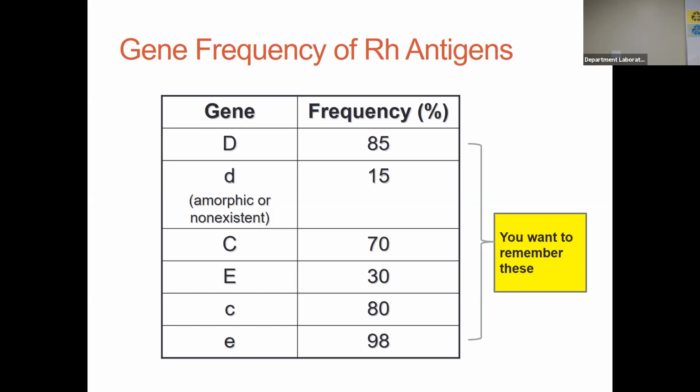All right, so that's why, and this is a real world situation. It happened to me. If you are in the blood bank on the weekend by yourself and a female comes into the OR and they are asking for blood and she has anti-little e, that is a nightmare for a blood banker by herself. I'm screening every unit on my shelf. I have a Red Cross reference lab. I have called them in to order units, and meanwhile the OR is screaming at me.